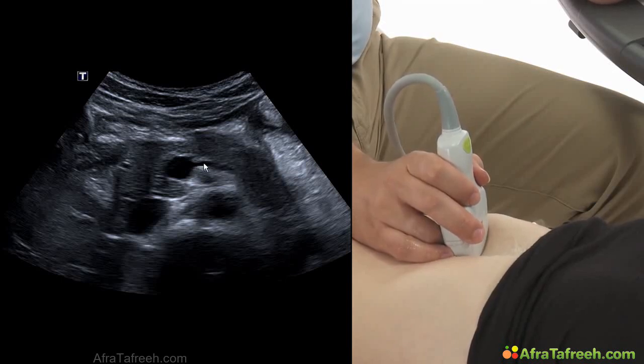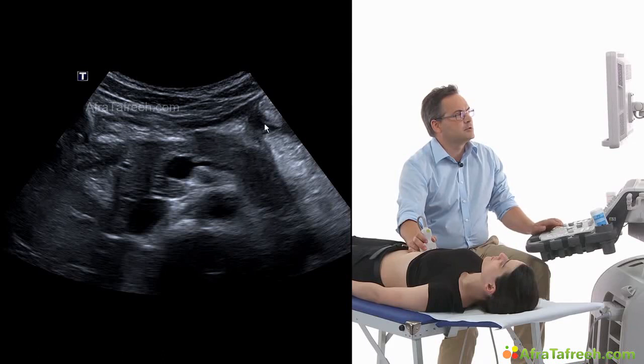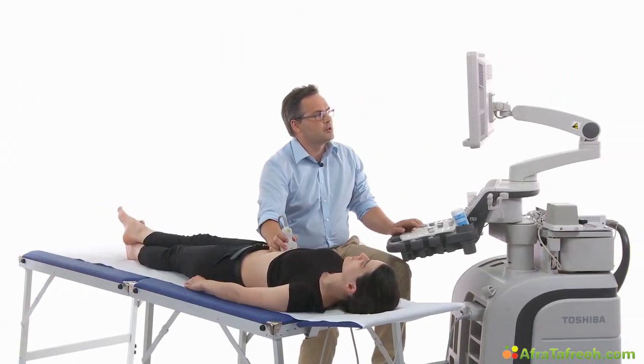the splenic vein, confluence of the vein, and pancreas over here. There is a small part of the stomach seen. So a lovely picture of the superior mesenteric artery. You have to look for the splenic vein.